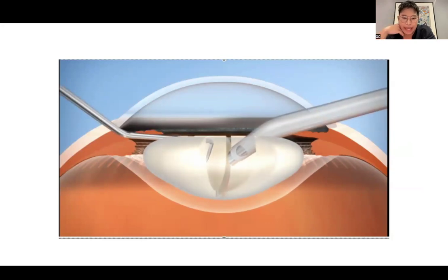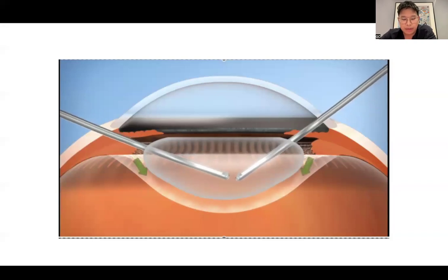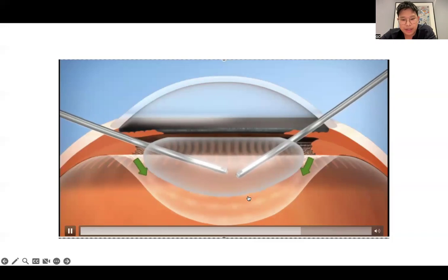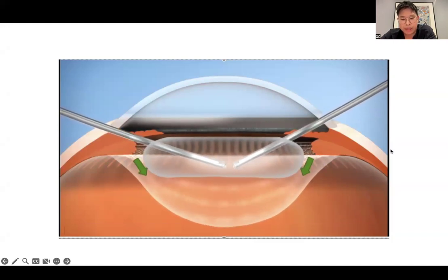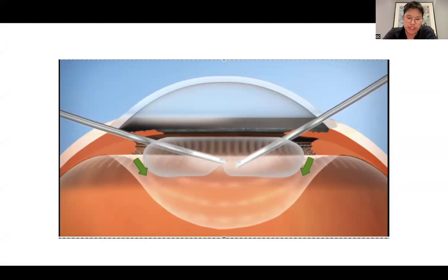What can happen is that after you're doing your cataract surgery with any infusion, especially if there's any zonular weakness, the fluid from the irrigation can start to infuse, and it can cause that lens to prolapse forward, as we can see in the video here. So what you're actually doing is hydrating Berger's space.